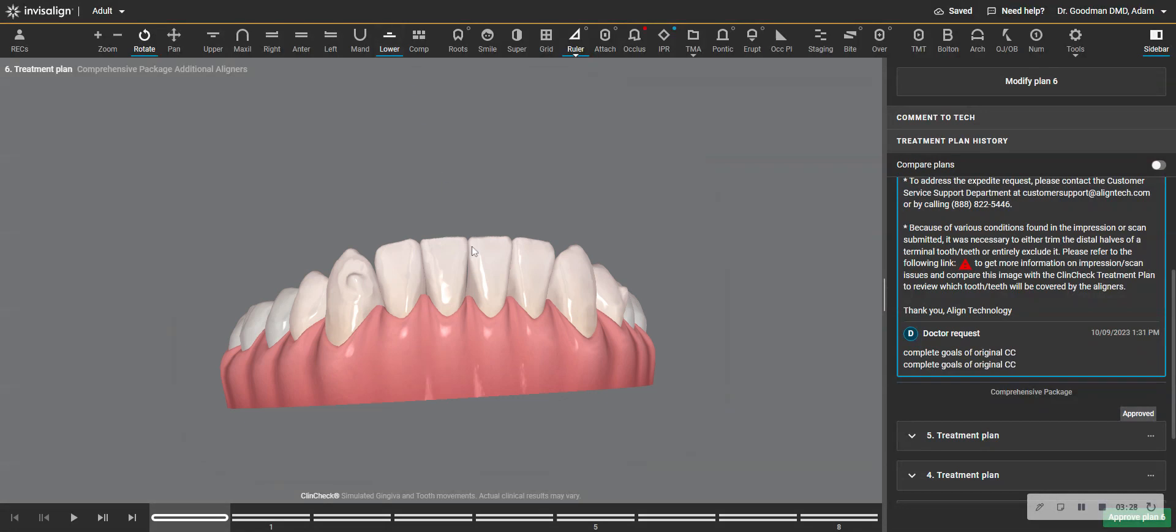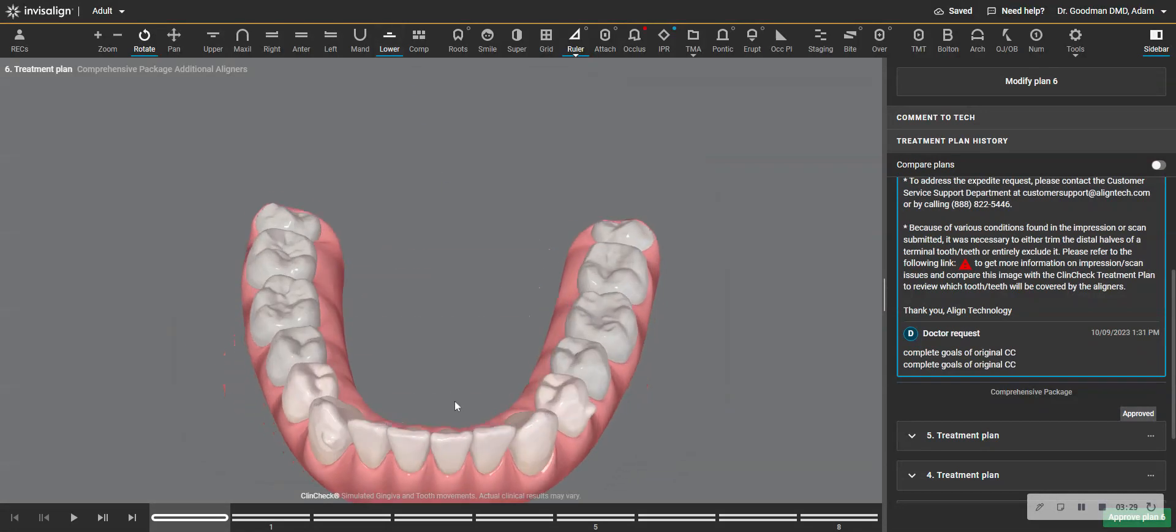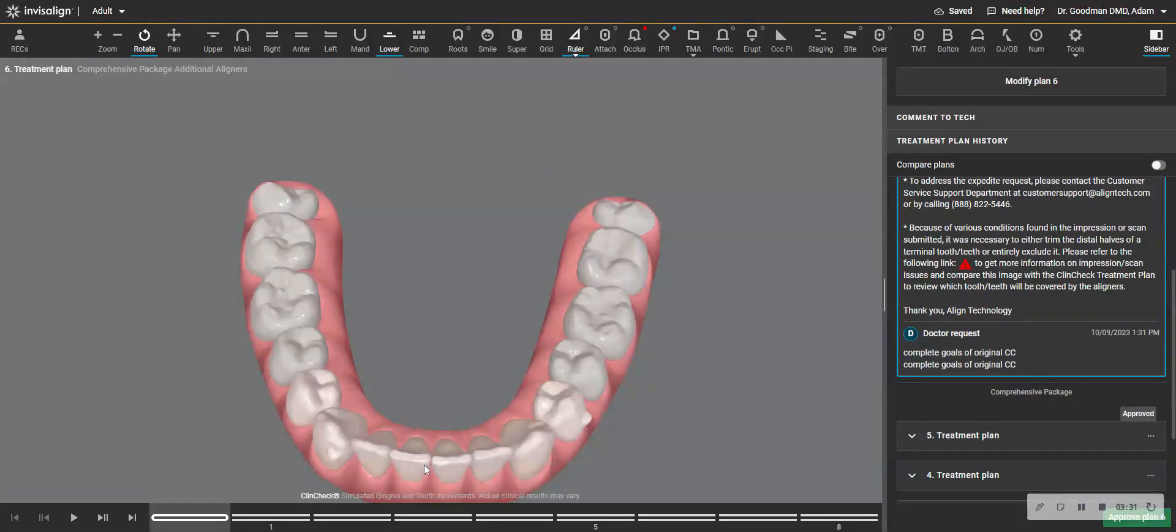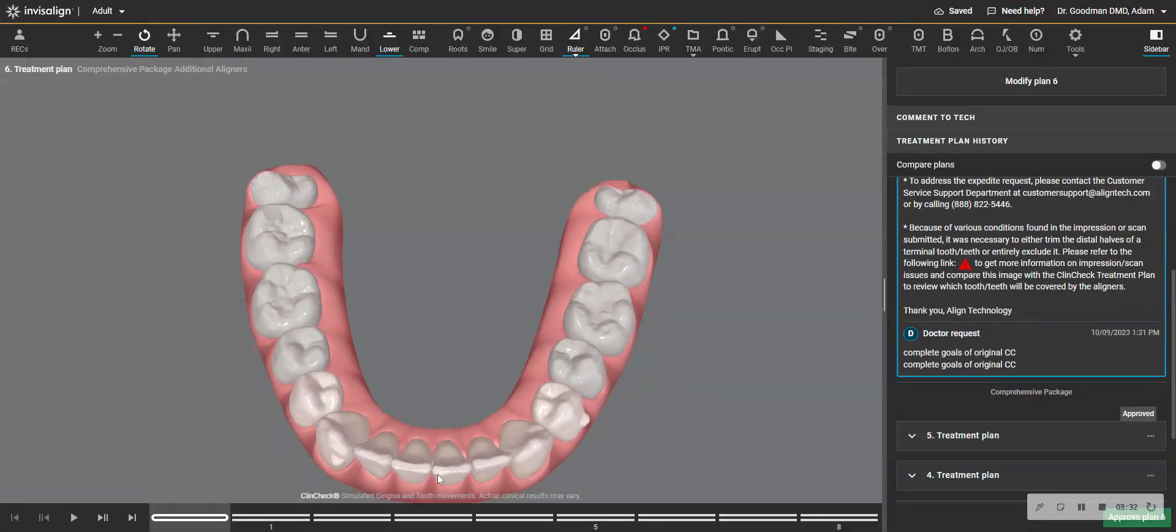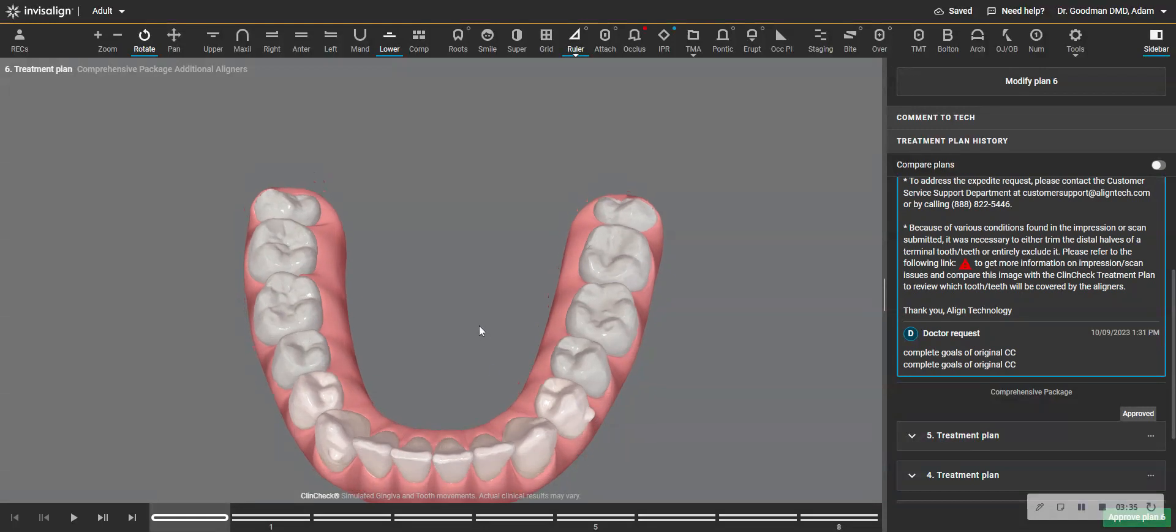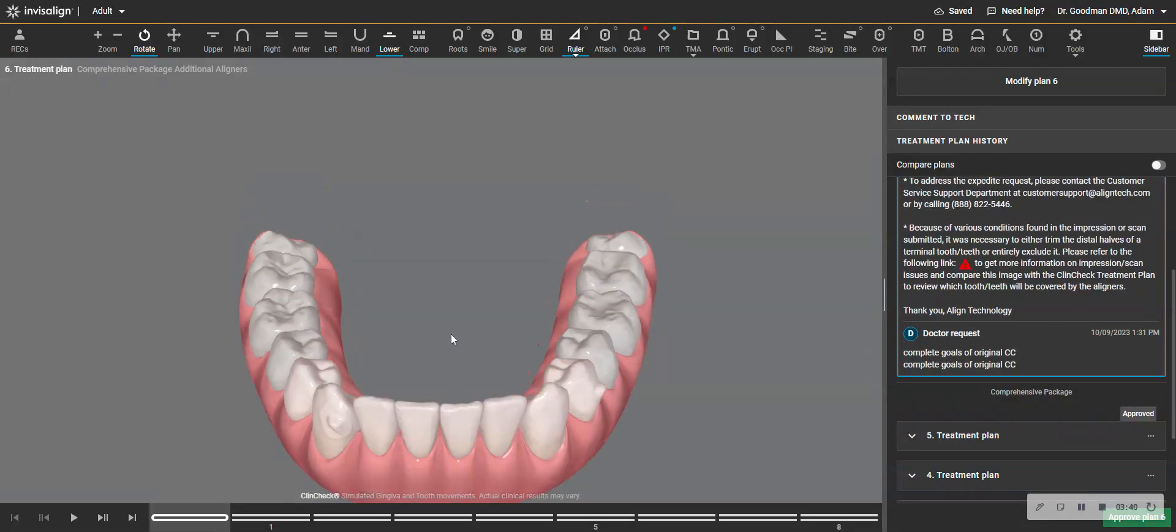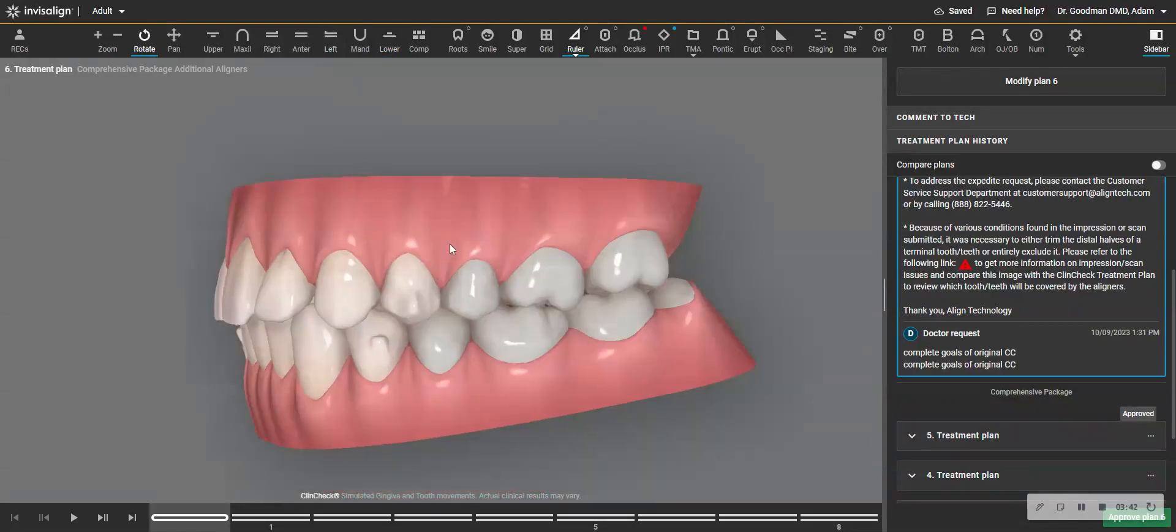You could even make a case if this tooth doesn't bother you, given how crowded it was, to just leave everything like it is and make you retainers at this point. But for sure, I'll tuck this in. That would take maybe three aligners.